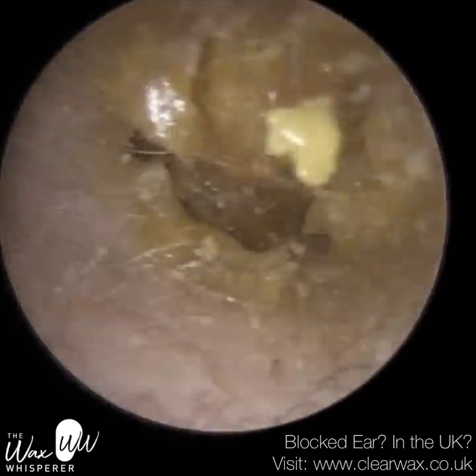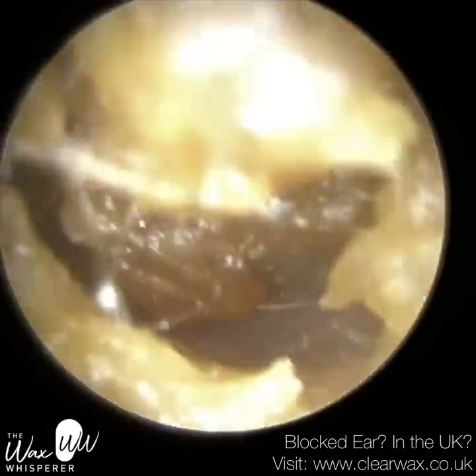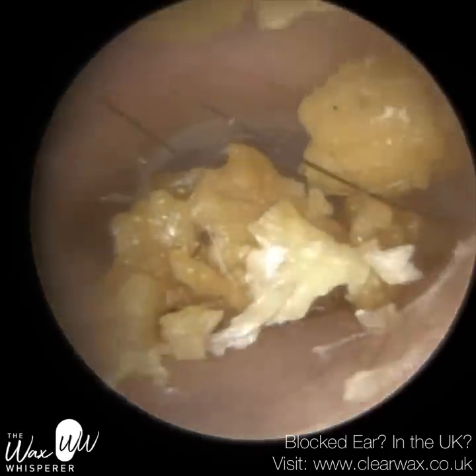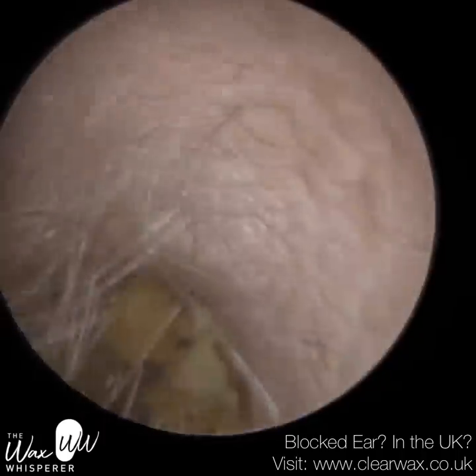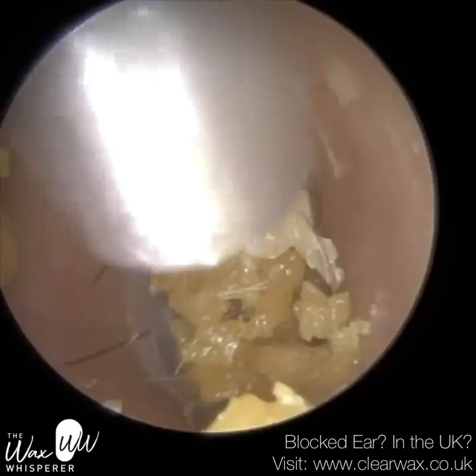Hi everyone, this is Neil Reiteter, also known as The Wax Whisperer. Thank you for joining me in my latest video. I have here a couple of patients who both attended for earwax removal or dead skin removal, but presented with incidental findings after removal of their wax or dead skin.